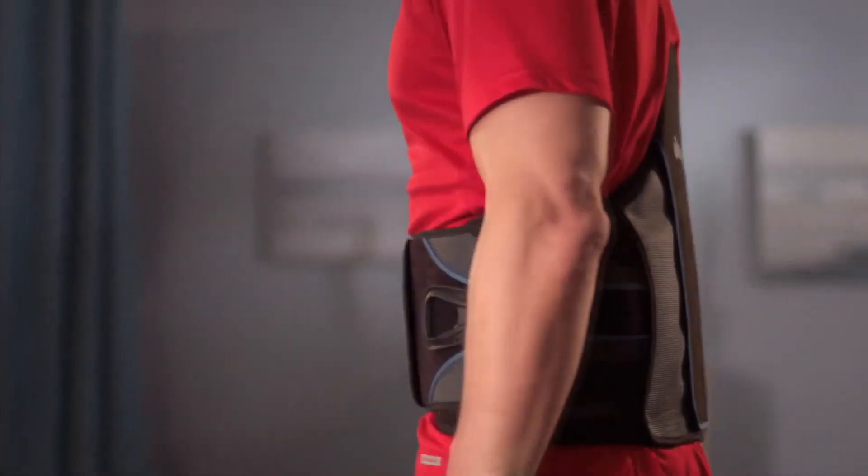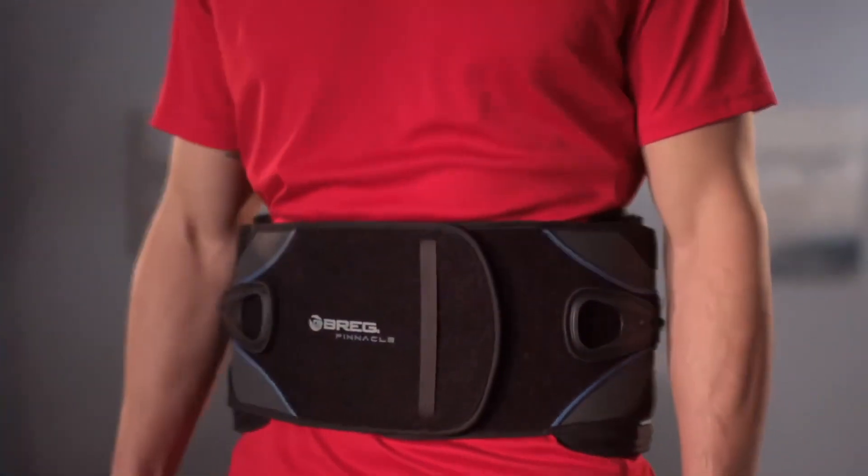The Pinnacle lumbar and TLSO braces have universal sizing and patient-centric features.